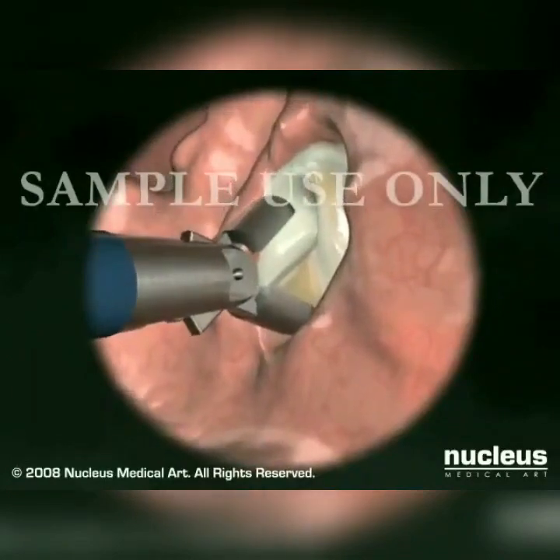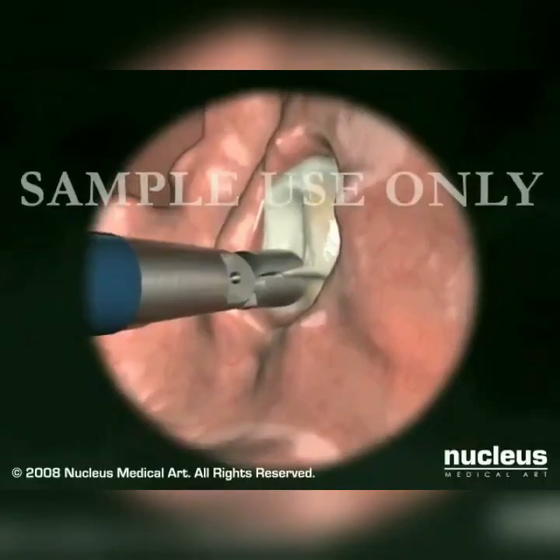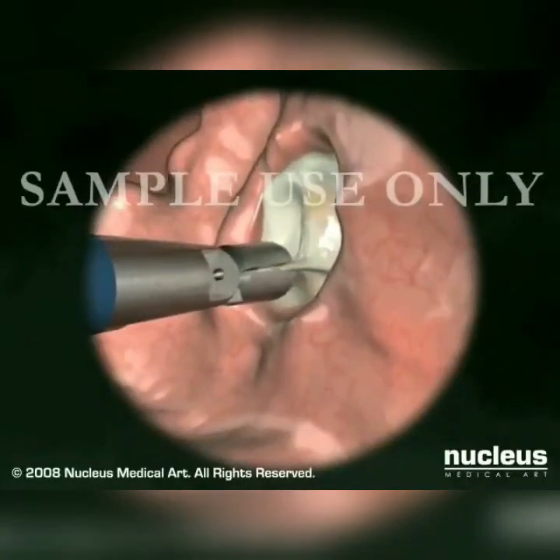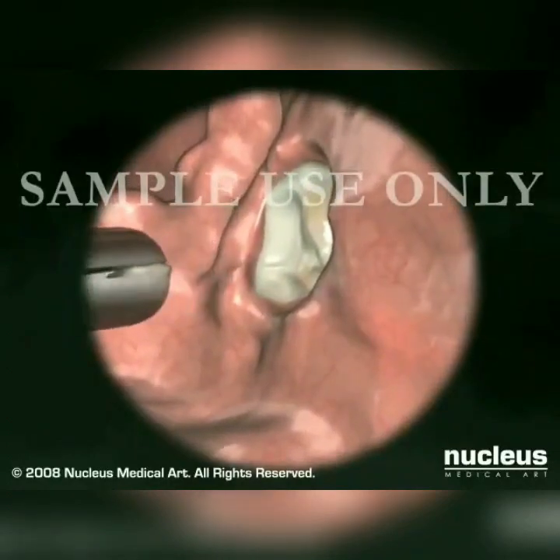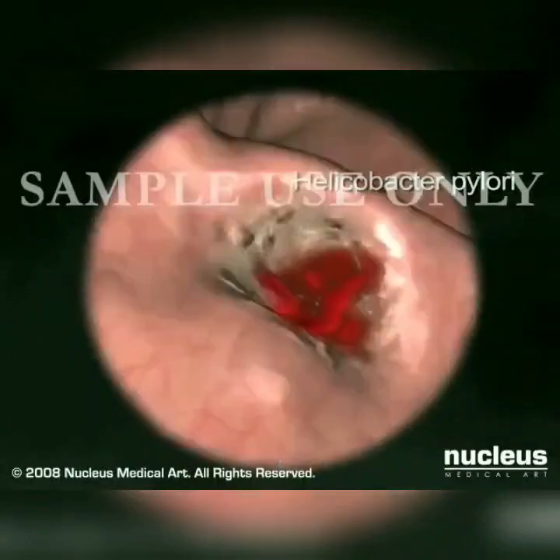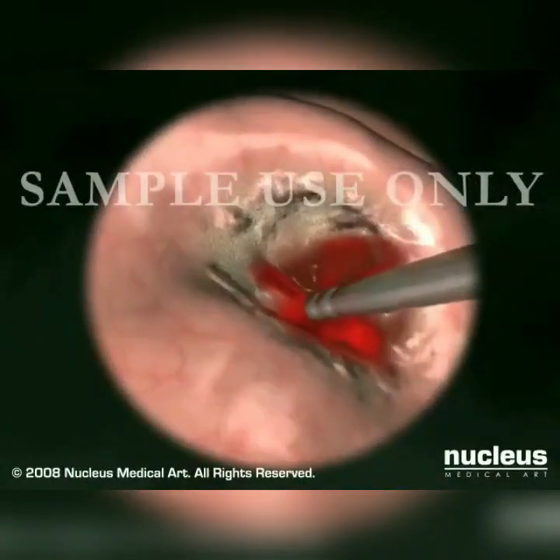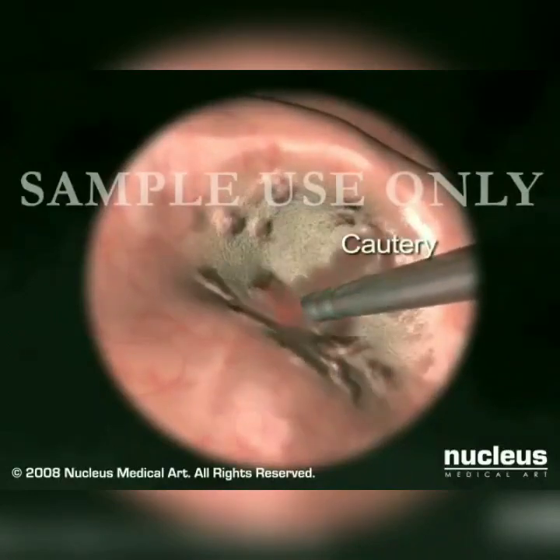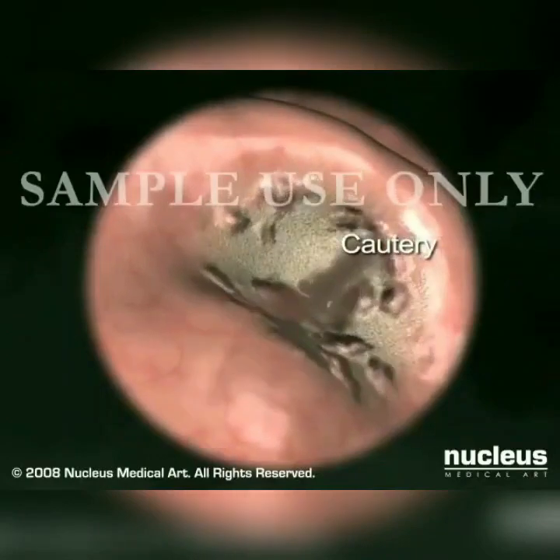If your doctor would like to collect a sample of tissue, he or she will obtain one or more biopsies through the endoscope for later examination. A biopsy will help distinguish between benign and cancerous tissues. It is also used to detect Helicobacter pylori, the bacterium that may lead to ulcers. Your doctor may also use the endoscope to treat a problem such as an actively bleeding ulcer or to stretch open a stricture or narrowing in the esophagus or stomach.